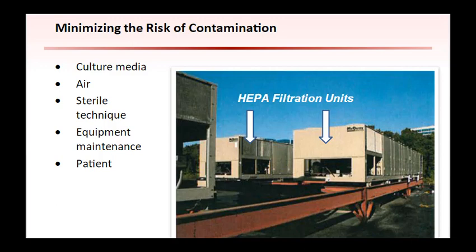Whenever medium is prepared or pipetted into dishes, sterile technique is essential. Working under oil minimizes the risk of contamination. Incubators must be kept clean, and water for humidification must be changed regularly. All equipment should be inspected by qualified technicians to ensure that it is in proper working order. On rare occasions, a semen sample will contain bacteria resistant to antibiotics that will grow in the culture medium. Testing should be performed to identify the type of bacteria.